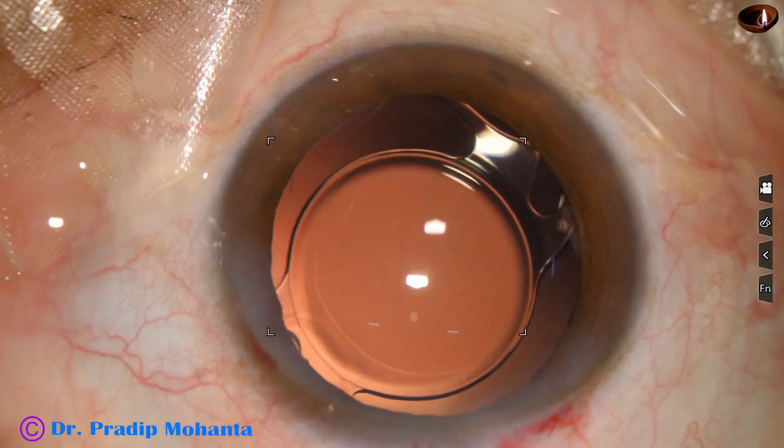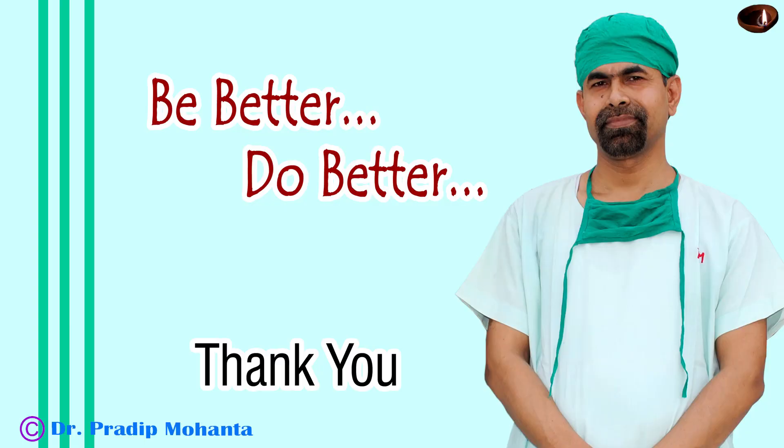A few drops of moxifloxacin are applied over the cornea and the case is concluded. Thank you very much for your attention. Hope this video will help you in developing your surgical skills. Be a great surgeon and serve your patients with love, respect, empathy, and great surgical competence.